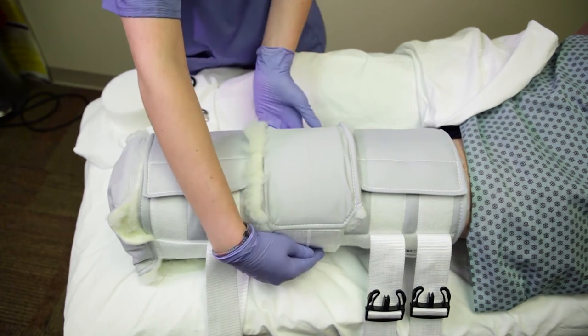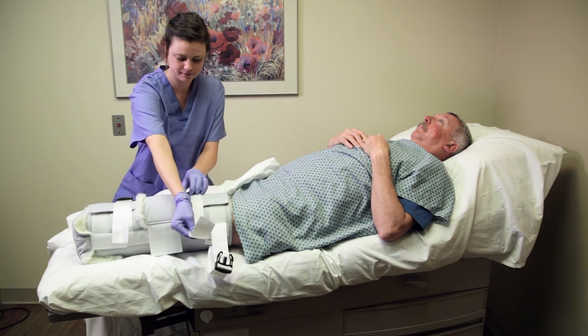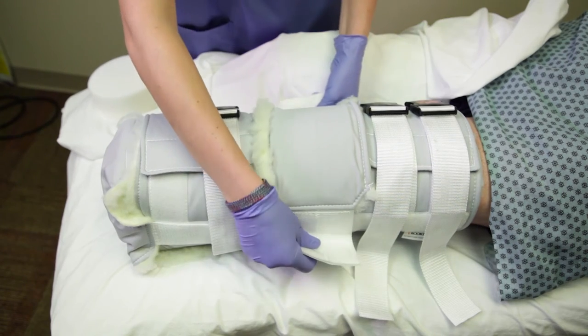Secure with light to moderate pressure. Do not secure too tightly. Lastly, close the straps with the buckles and pull or loosen the straps as needed. You may want to check again that the patella is located correctly.